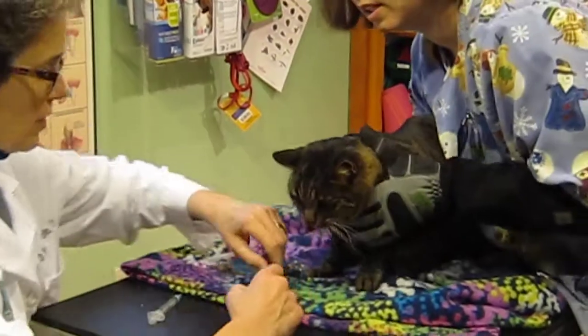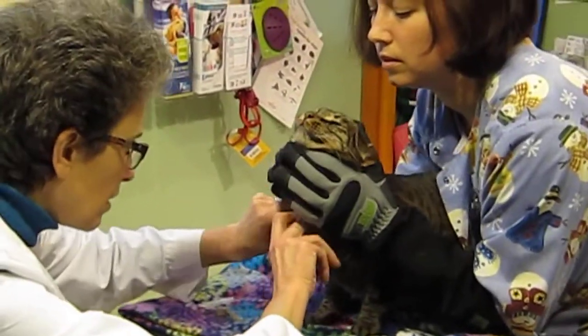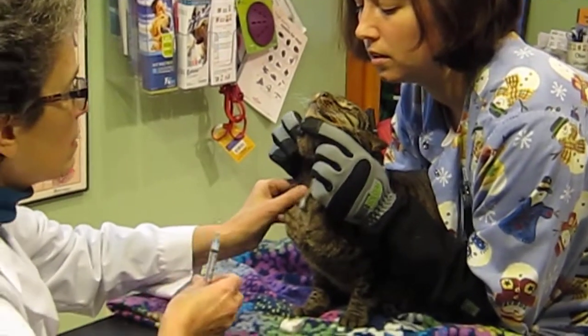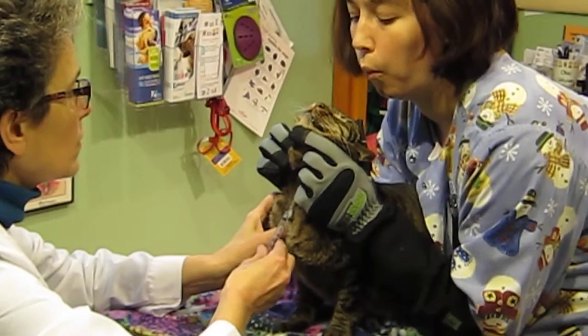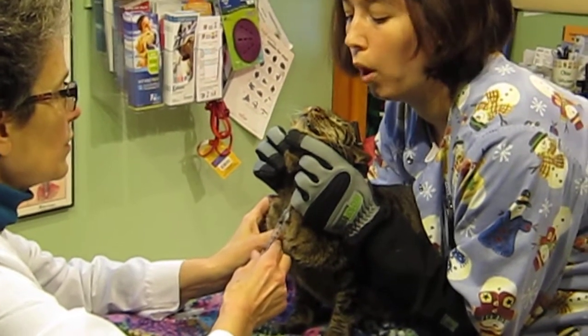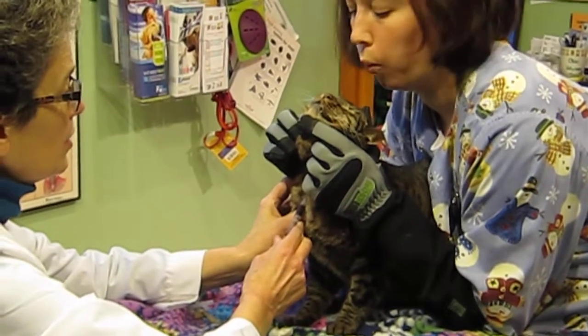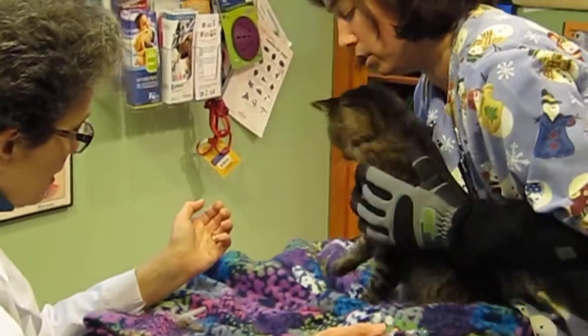Now we put some numbing stuff on you. Good boy. And your fingers aside — good boy, he's a good boy. Much better, especially without the truck going by. There you go — we got your blood. Okay, done. Yes, we're all done.